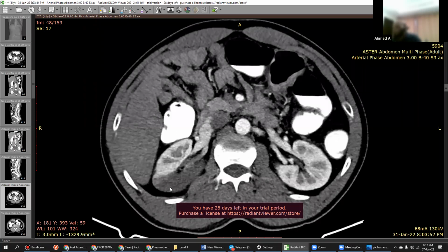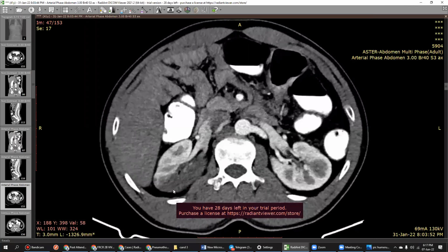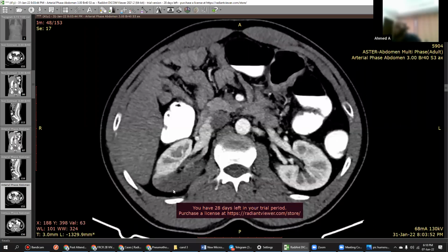That capsular rim sign occurs not because of obstruction. It occurs because the capsule of the renal parenchyma is supplied by a capsular artery, and that capsular artery arises from the main renal artery instead of the segmental artery. So that's why it is spared, and you'll have this rim of capsular enhancement. If it is seen, it is very much suggestive of renal infarct.